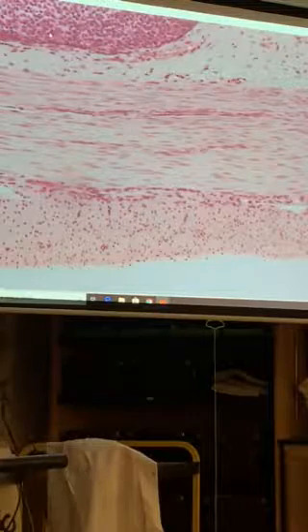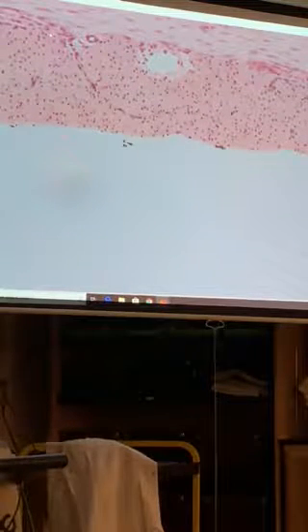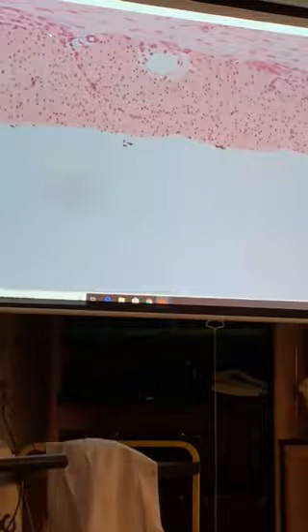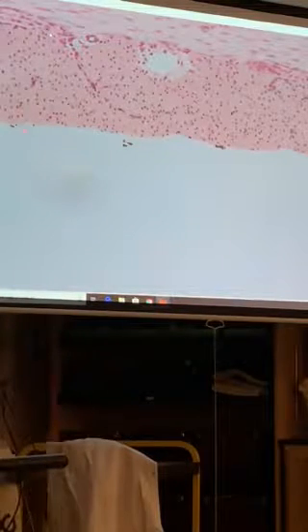That was number 16. Number 17, let's name a main layer. See kind of clear on that edge, just right there where I have the pointer, not the black stuff, but that kind of wispy looking edge. Name the main layer.